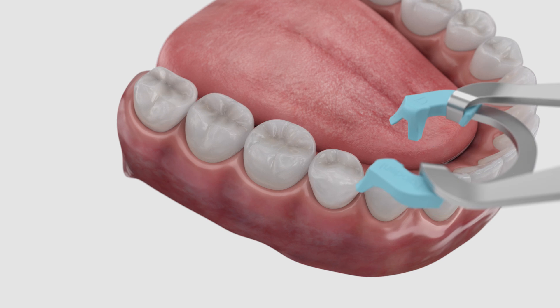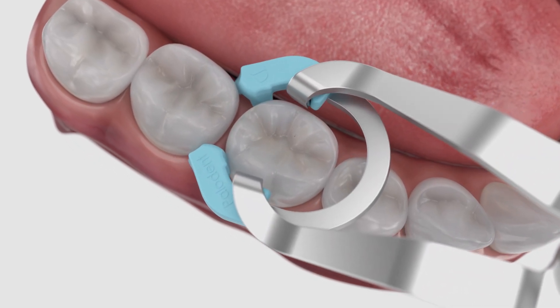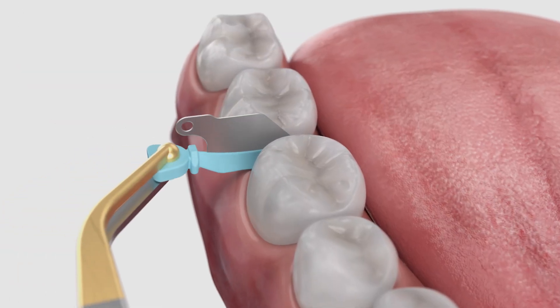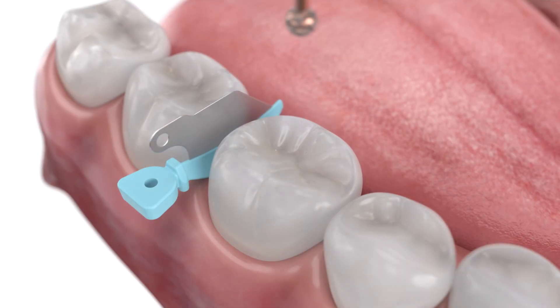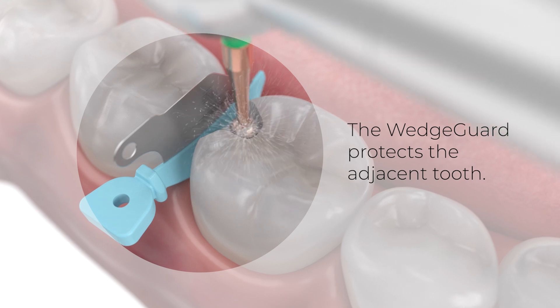First, if needed, place the appropriate Paladin Plus ring prior to cavity preparation to provide the necessary separation. Select the appropriately sized wedge guard and place interproximally. The wedge guard will help to protect the adjacent tooth during prep.